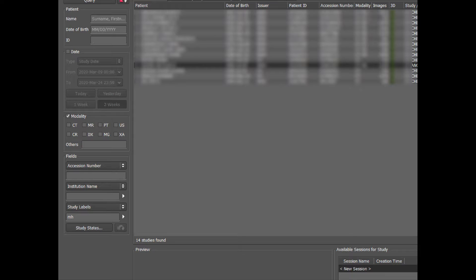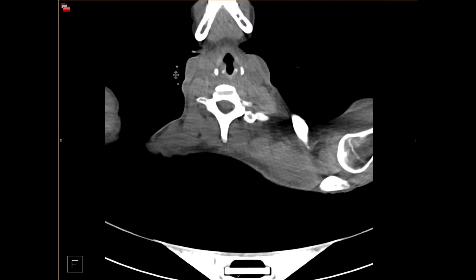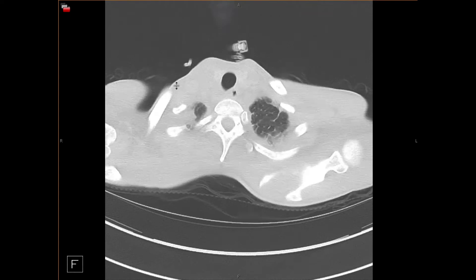The third main category causing the reverse halo sign is infection. You have to consider the host — immunocompetent or immunocompromised — and other historical factors. In neutropenic patients in particular, there is increased risk of angioinvasive fungal infections. While the most common is aspergillus, we always have to consider mucormycosis because it requires stronger antifungal therapy. One way we can suggest mucormycosis based on imaging is the presence of a reverse halo sign.